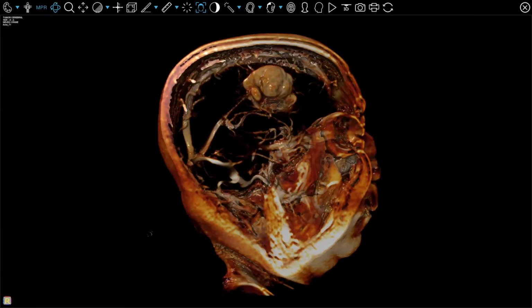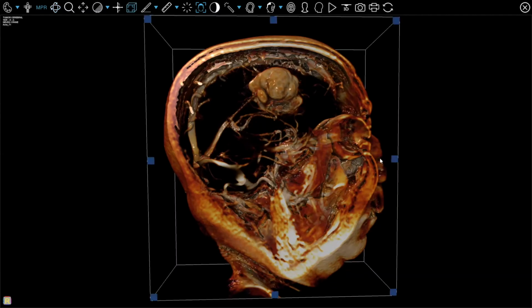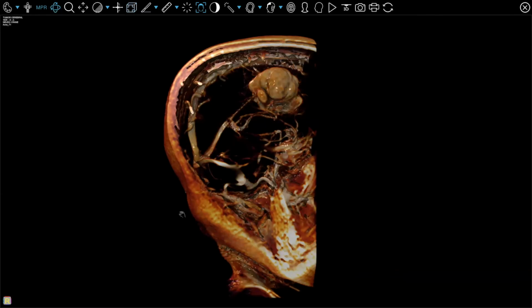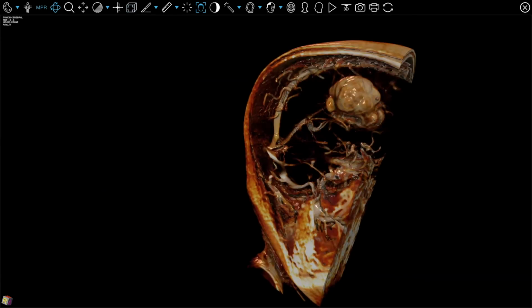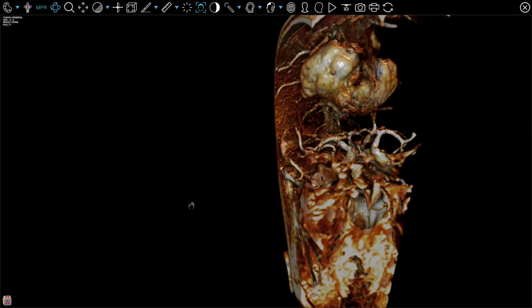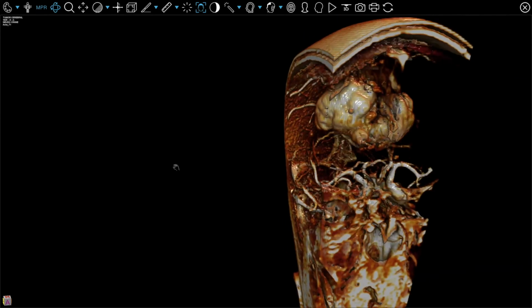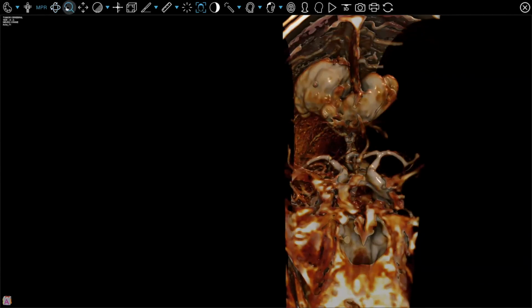In this case, we will have the tumor, as you can see. We did an overlay to understand what arteries are feeding the tumor, and we will separate the tumor to have a clear view of that, removing the skin and some parts irrelevant for us in this procedure. You can see the circle of Willis. You can see basically the tumor. We can measure the tumor as well.